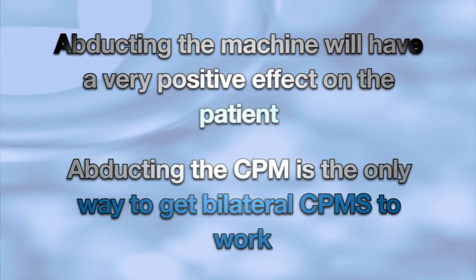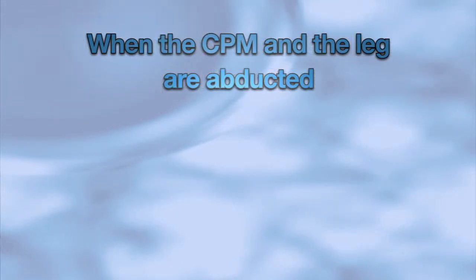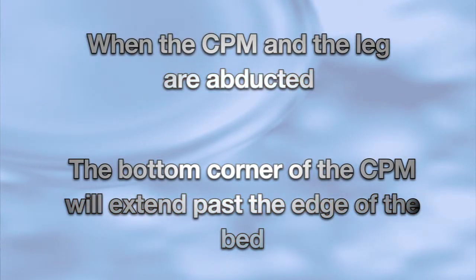You will also find that abducting the CPM is the only way to get bilateral CPMs to work. When you do abduct the CPM and the leg, you may find that the bottom corner of the CPM will extend past the edge of the bed. This is okay and will not affect the movement of the machine or the patient's safety.